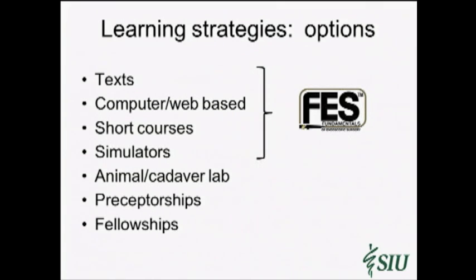So where would FES fit into this kind of model, as I think as a surgical educator, as a program director, about how we equip people with new skills? Well, actually, there's a number of ways we can do this, and listed on this slide are some of the ways I've thought about helping someone build endoscopic skill. And you can see that FES really offers us the opportunity to leverage a lot of the early part of this sort of graduated curve for how to teach skills.